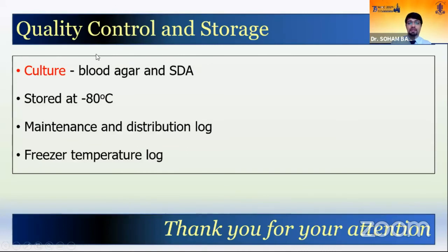Along with it, what are the quality controls? We look at the culture. Blood agar and Sabouraud dextrose culture, and the tissues, amniotic membranes, are released for surgery only once both the cultures are negative. And the logs to be maintained are a freezer temperature log and a maintenance and distribution log. This is for your quality control purposes.